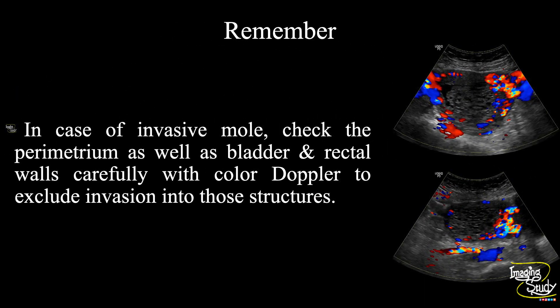The take-home message: in a case of invasive mole, don't forget to carefully check the perimetrium as well as the bladder and rectal walls with color Doppler to exclude invasion into those structures. This may be well appreciated on transvaginal sonography as well as on MR imaging, but if you get the patient, don't forget to check them on transabdominal ultrasound also.